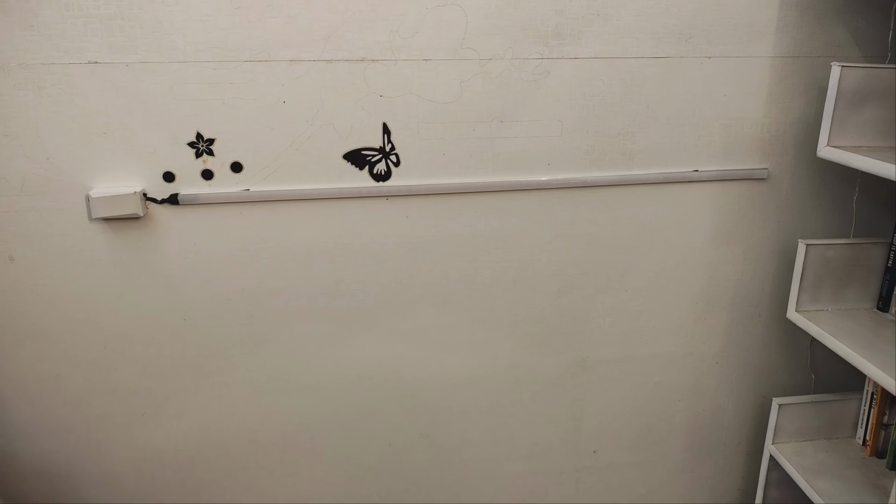Commercial EMDR devices are expensive, limited, and often not customizable. So I decided to build my own for my PTSD, complex PTSD, and treatment resistant anxiety clients. This is a Wi-Fi controlled EMDR machine with smooth natural eye tracking, adjustable motion dynamics, breathing modes, and real-time control from my phone.